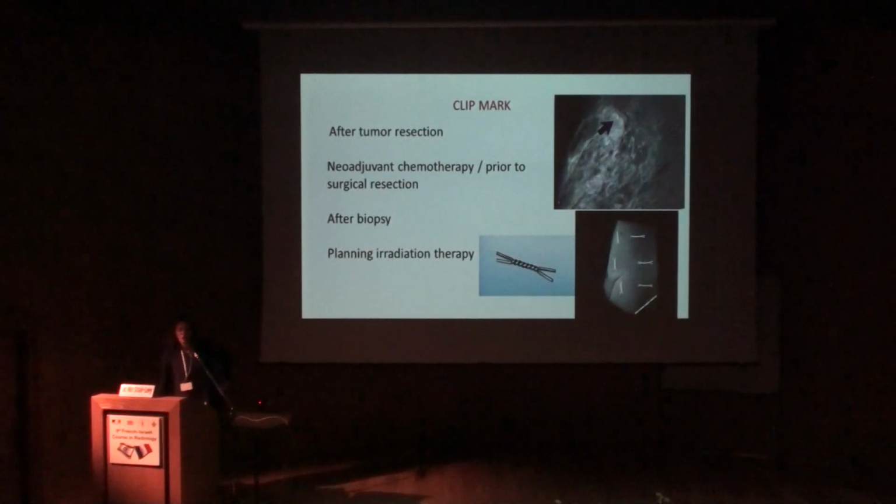Another intervention that we are doing is the clip mark. The beginning was in women with locally advanced breast cancer. Today, some of the women, according to different protocols, undergo chemotherapy before surgery. In many cases, the tumor disappears.